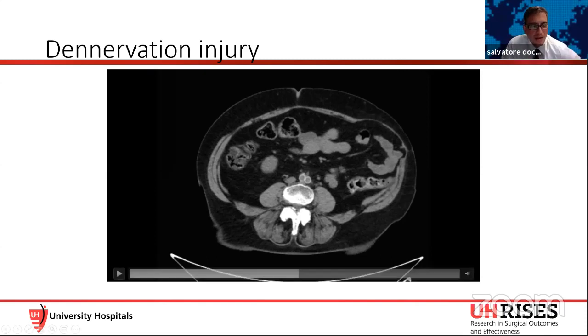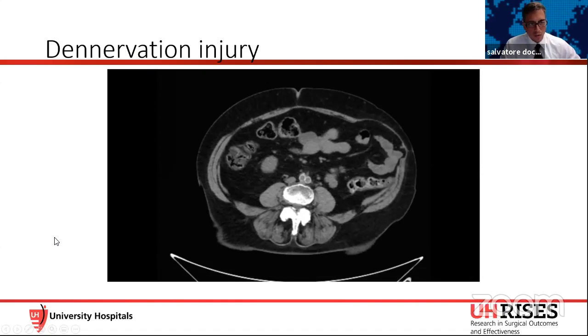Not to skip ahead, but in this patient in particular, when you have that denervation, it's obvious, comparing the two different sides, plus the decreased blood supply that we point out here, would you obviously stay away from anterior component separation or attempt sparing, or would you just go for posterior repair? I mean, that's obviously the importance of understanding what's going on radiographically.